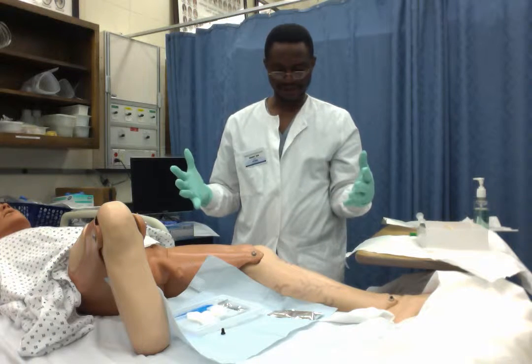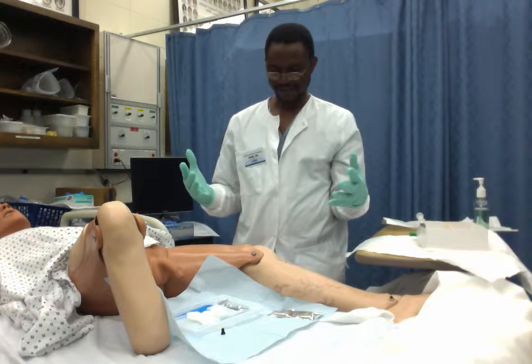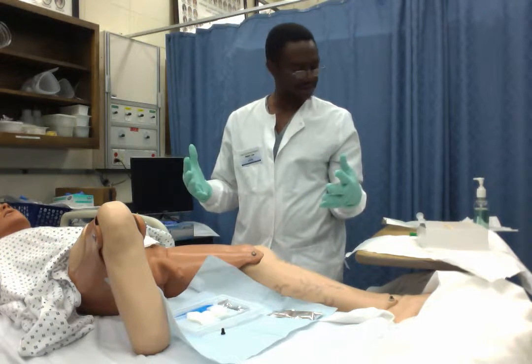Having set my sterile field and prepared my equipment, I will now proceed to clean the penis with sterile fluid.